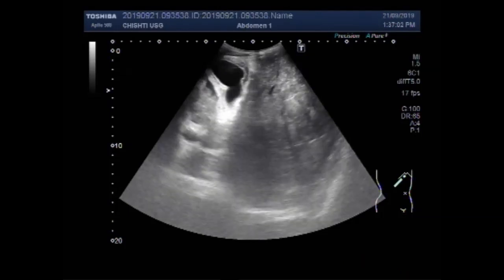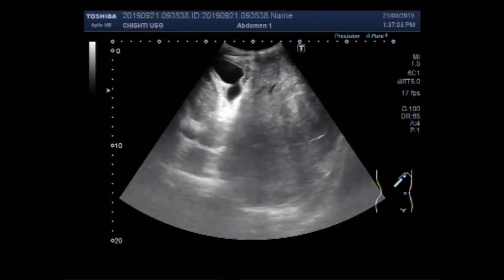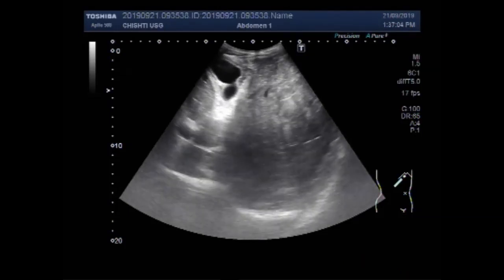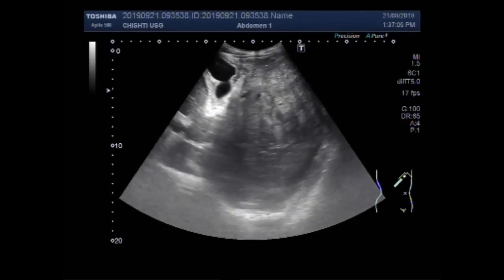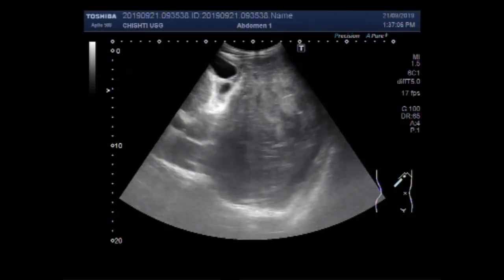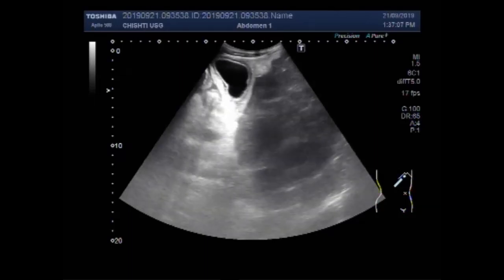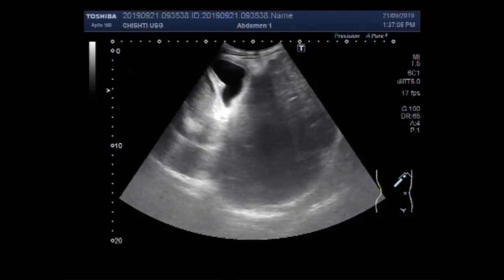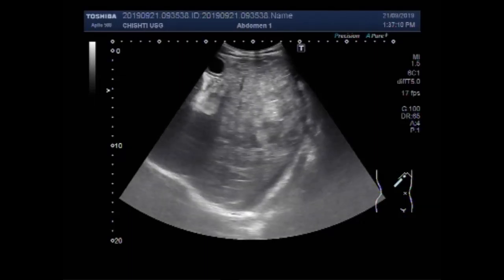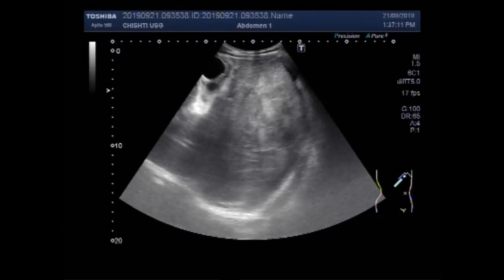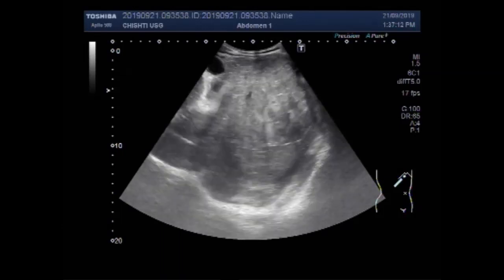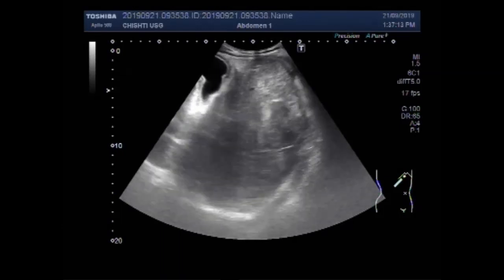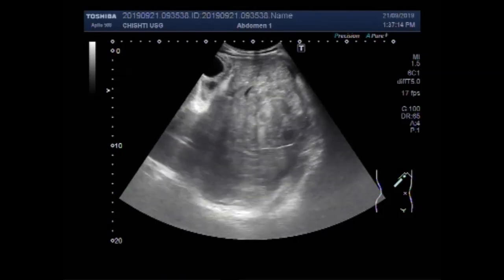This is the liver and gallbladder. You can see the gallbladder is thick-walled and there is edema along the walls of the gallbladder.